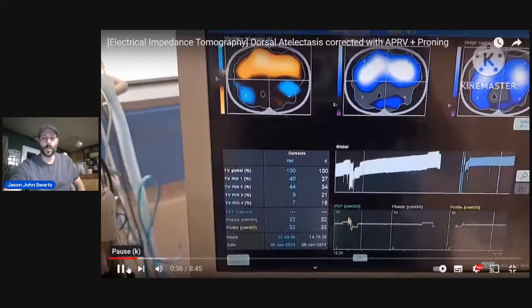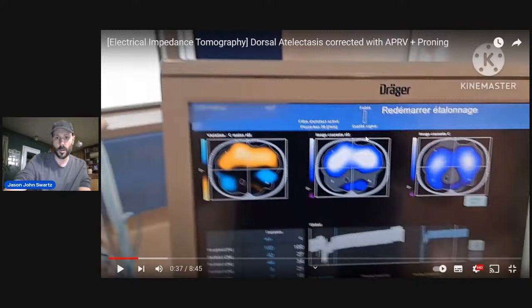All right, so when we're looking at this, this is on ACPC with the PEEP of 8. We were getting with a peak pressure of 32 set, so that's a large drive pressure. And we were still just getting for her 300 and some tidal volume, which she's small, so that's like 6 cc's per kilogram of ideal body weight. But we can see over here, think of this as a CT scan, and this whole blue and white stuff is aeration. So all the aeration is trapped on the ventral and mid-ventral area.